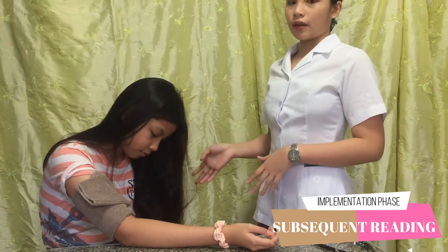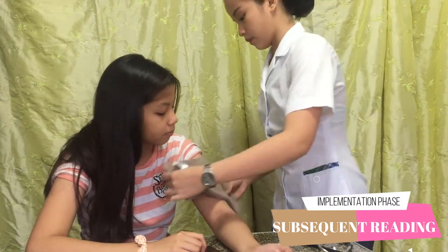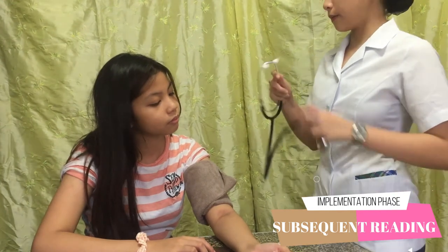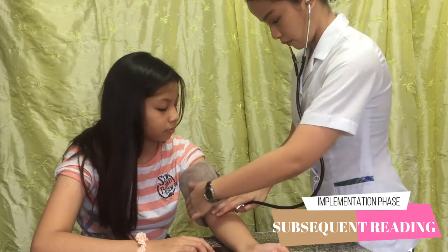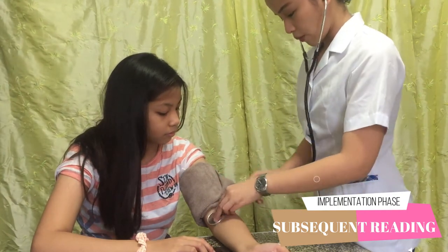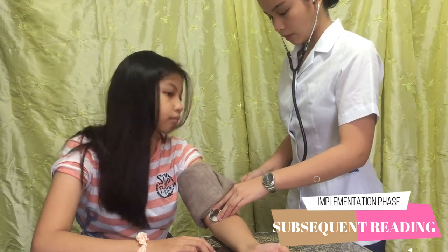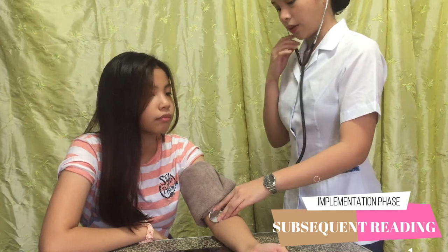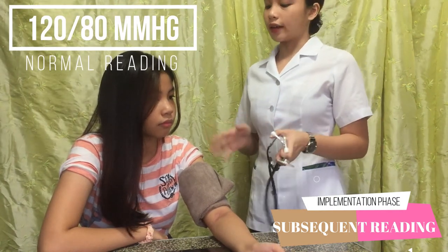And then we are going to assess the other side now. So now we are going to proceed to the other side and use our stethoscope again. And then we are going to inflate it, and then deflate. So it is the same with the other side — 120 over 80 mmHg.